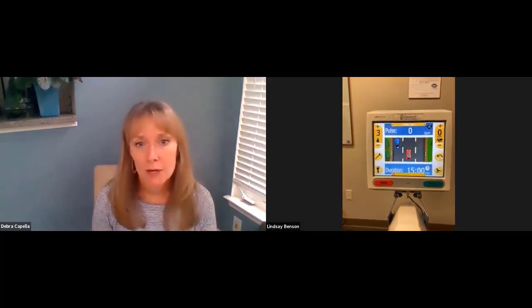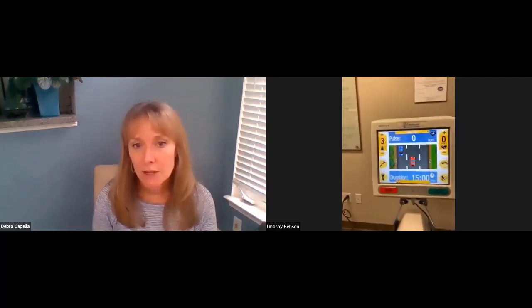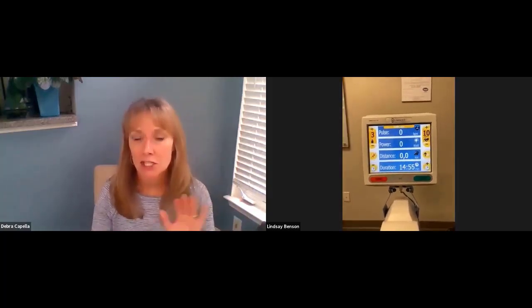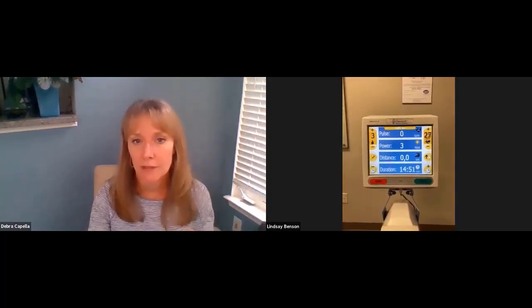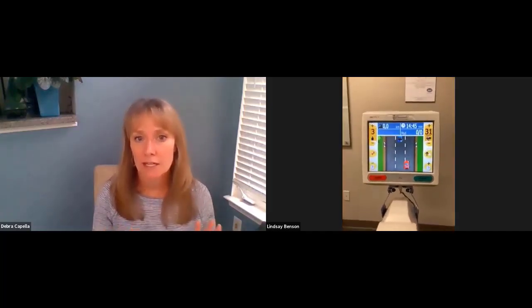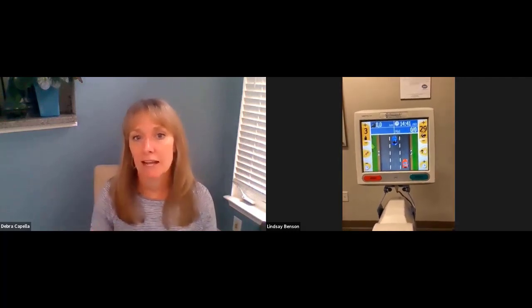Okay, so we're on the lower extremity. This is only a lower extremity option, and she's going to hit start. And when she hits start, the pedals will start going again at that baseline 10 RPM. And then as she engages and starts working, take a look, we get that yellow light floating up there on the light bulb. And now I'm on the traffic jam. Again, her goal is to avoid the car that's coming in front of her. So she has chosen to use her right leg to get into the right lane.